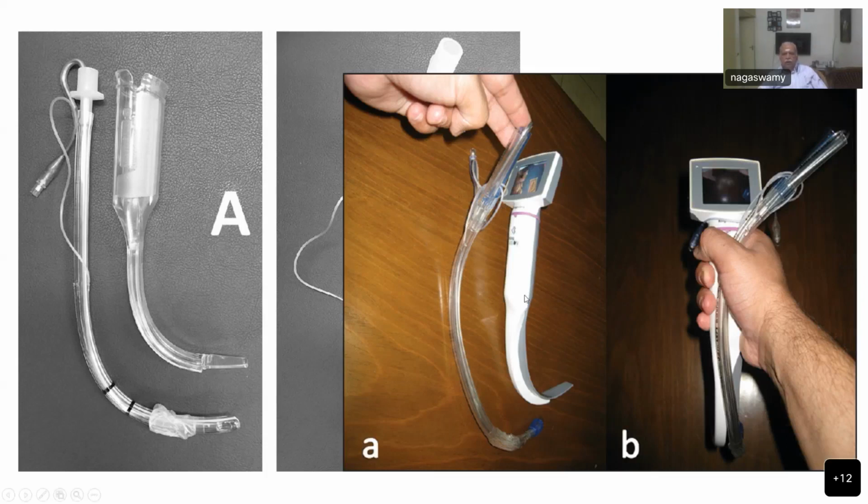This is how the two types are. This is the unchanneled blade being used, and the person is trying to introduce the tube separately. Whereas if you have the channel, you have to hold the tube together with the handle so that you can visualize and then push the tube inside.